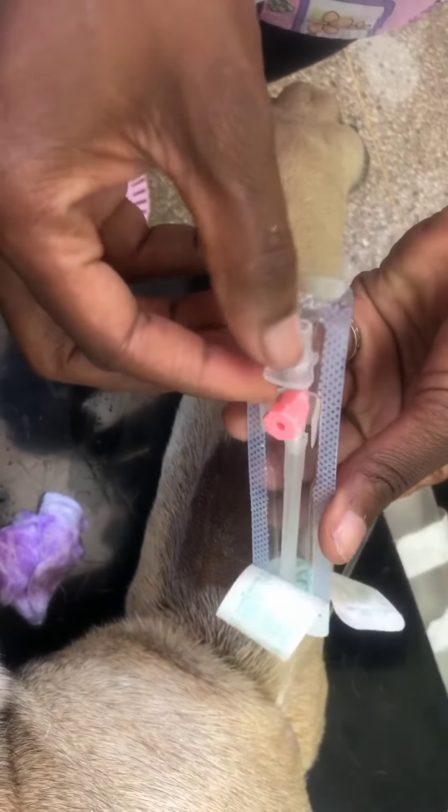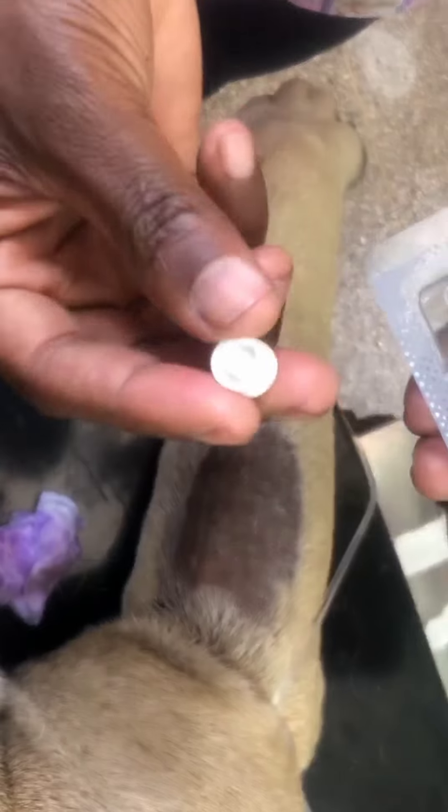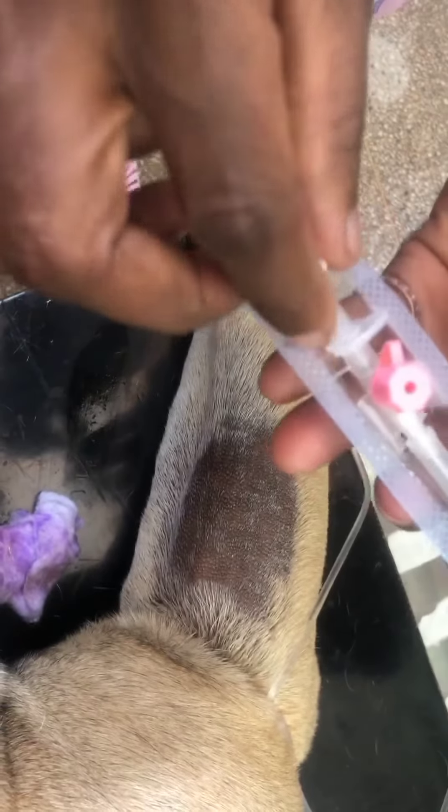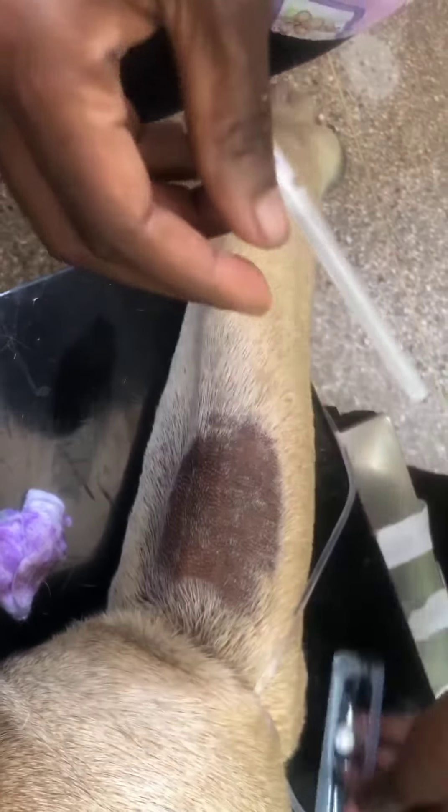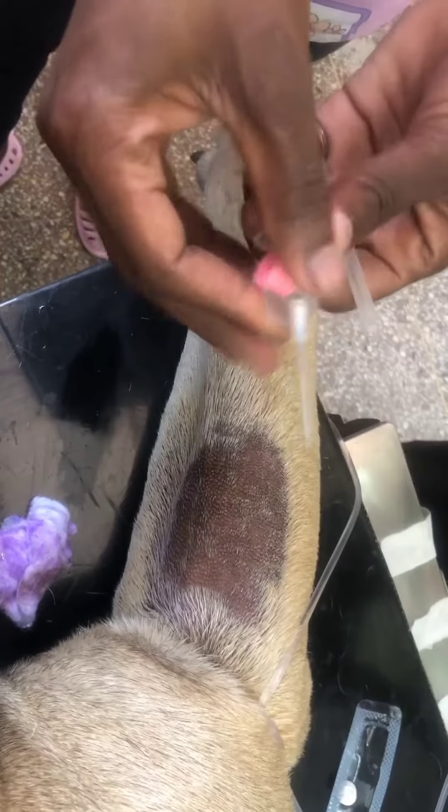I'll be using this cannula — it's winged, it has wings. It's a 20-gauge cannula and there are different cannulas on the market, but this is what's available.